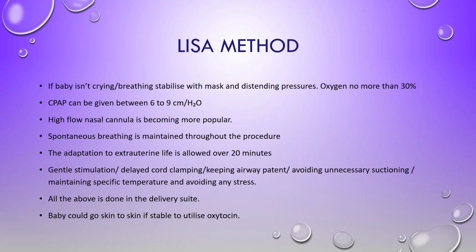High flow nasal cannula is becoming more popular as well, and this method will work well if the positioning is correct. Spontaneous breathing is maintained through the procedure. The adaptation to extrauterine life is allowed for over 20 minutes. So there already you see that they are pushing that envelope.